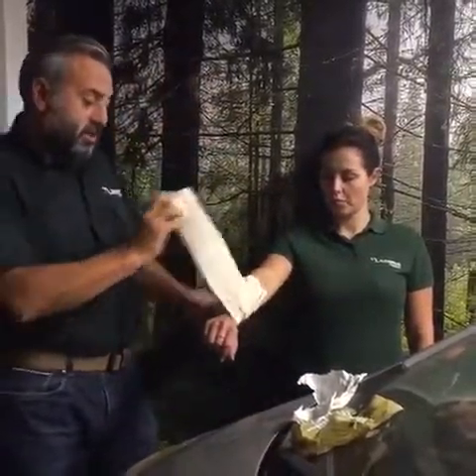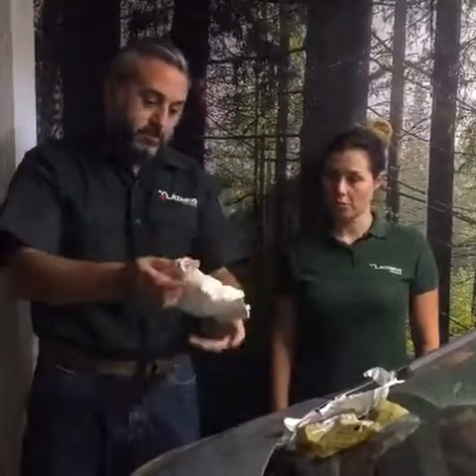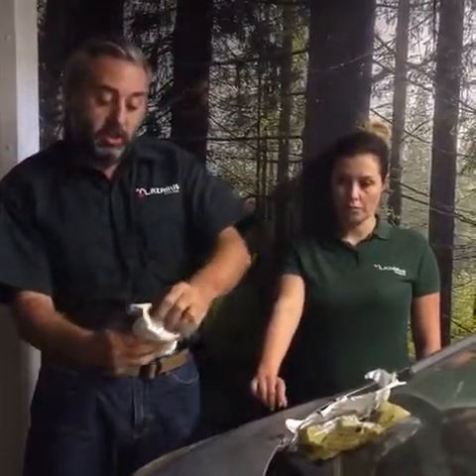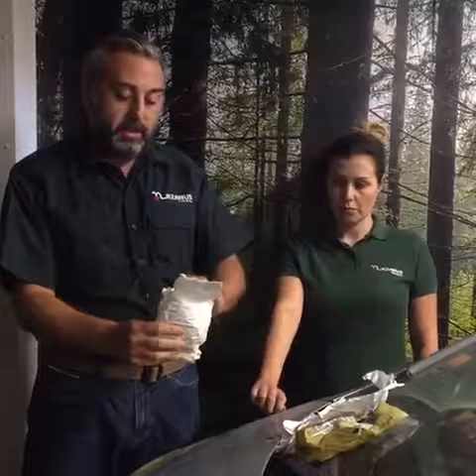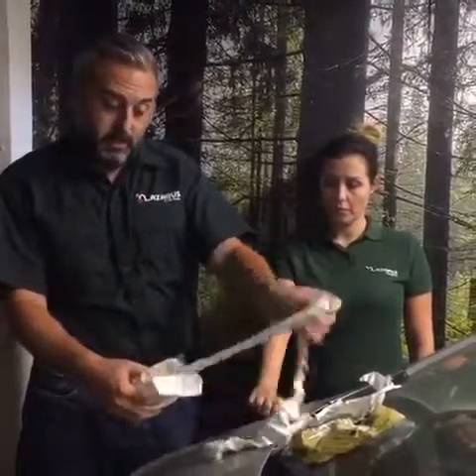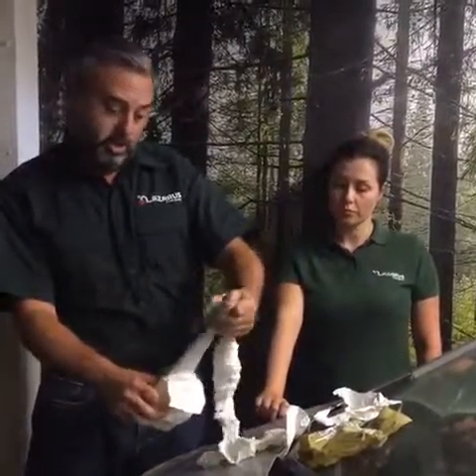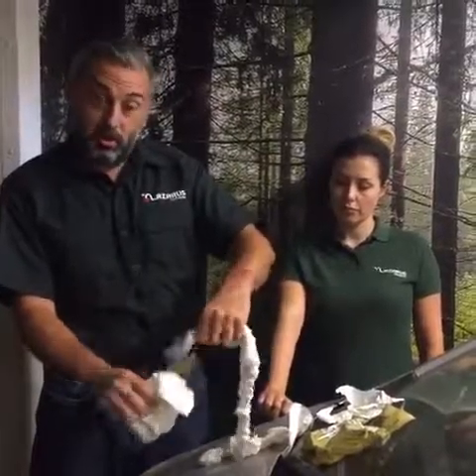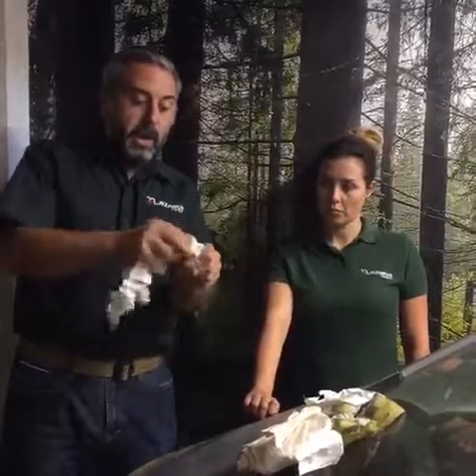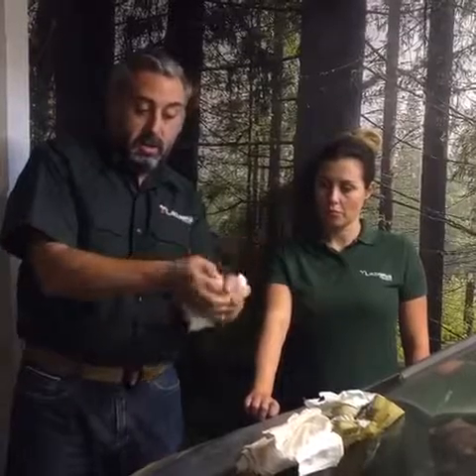We like these OLAES dressings because they've got everything you need, but it does have a few hidden extra tricks. Coming back to the pads — which I just put straight onto the wound — it's actually got an open end. If we open that end up, it reveals two little secret bits inside. One is that we can pull out the padding. The idea of packing wounds has been well established and has been given a turbo charge in recent years with the idea of what we call clotting agents. If there's a hole in the person, we need to pack the wound before we wrap the dressing round, and then that can go over the top.